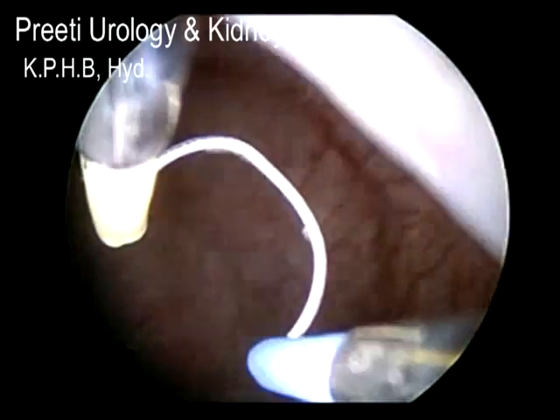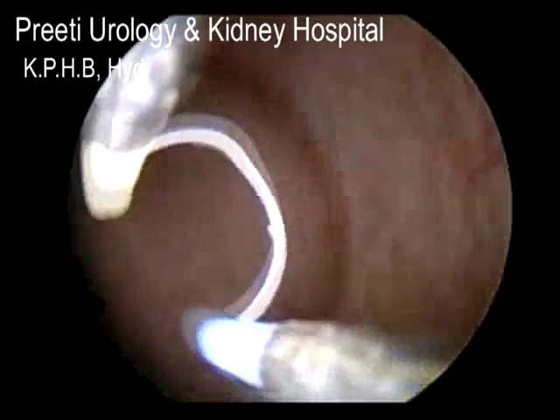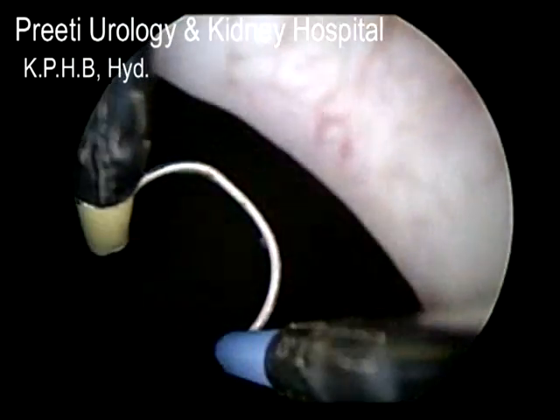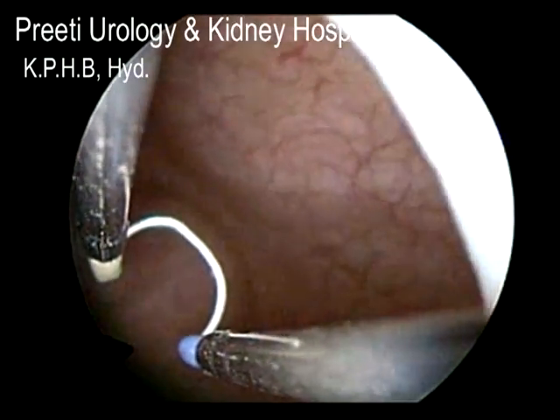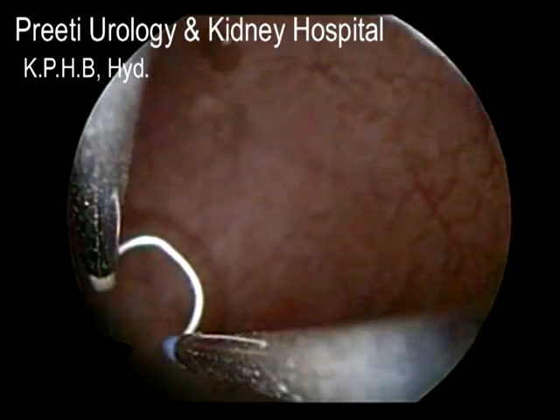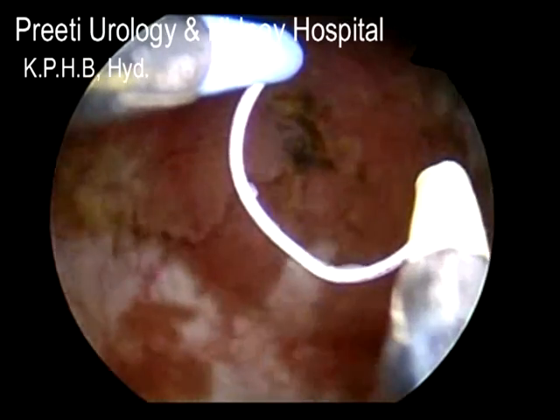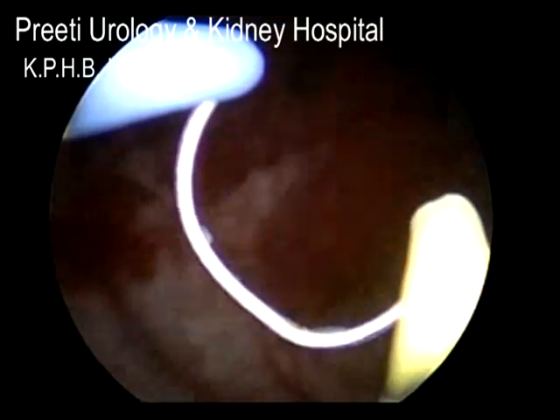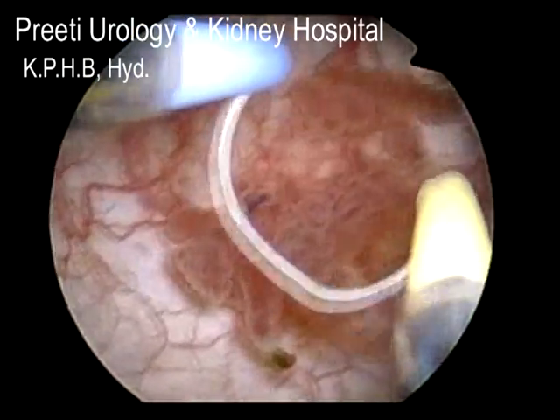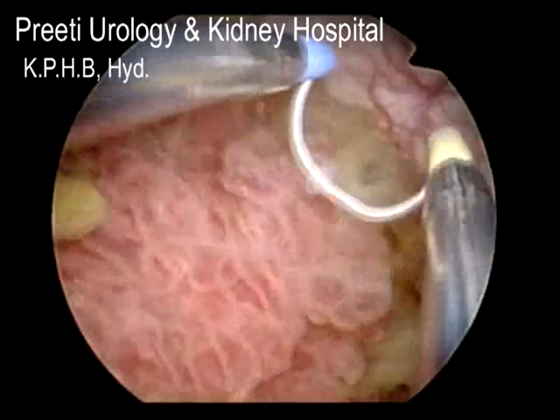Sometimes we empty the bladder to detect the same. Now this is the bladder neck, and you can see the air bubble. Somebody is pressing so that we can see whether the tumor is there or not. Now we will start resecting the tumor. So you can see that small lesion. Now we will start resecting the tumor.